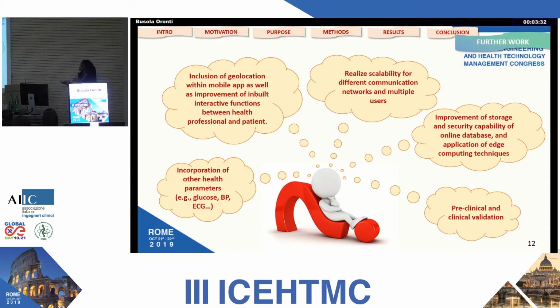Secondly, the inclusion of geolocation, that is the identification of the patient location within the mobile app. Right now, it is taking place outside of the mobile app, but we want it to take place from within the app, and also to improve inbuilt interactive functions between the health professional and the patient. Another thing we want to do is to realize scalability for different communication networks and multiple users. And of course, we're looking at improving storage and security capability of the online database, and possible application of edge computing techniques.